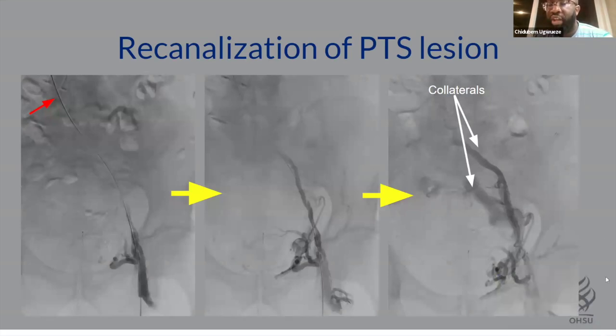external common iliac vein from a prior DVT that led to post-thrombotic syndrome. As you can see in this case, we're doing a venogram from the left lower extremity, and as the contrast volume flows in, there are large collaterals going across the pelvis and getting into the IVC that way. There's no native iliac vein on this side.